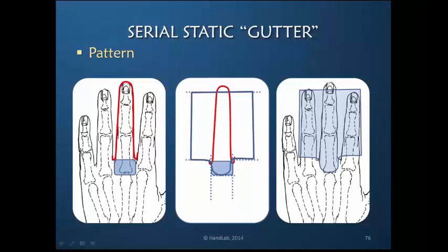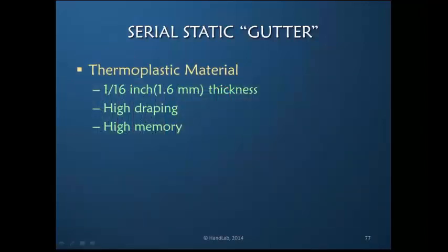It's also important to choose a thermoplastic material that is thin — 1/16th inch or 1.6 millimeters is the thickness of choice. The material needs to have both a high draping capability and a very high memory capability. We are going to heat the material, wrap it around the finger, and cut it down the top of the finger so that it stays together in a tubular shape. It is the memory of the material that holds it onto the finger snugly, so if you choose the wrong material this pattern will not work successfully.